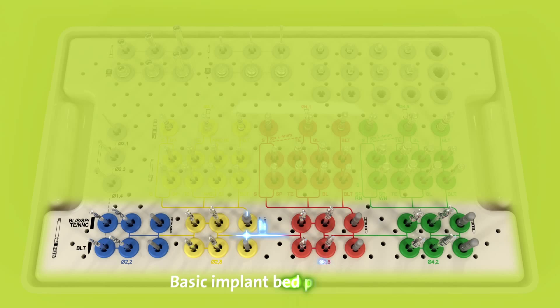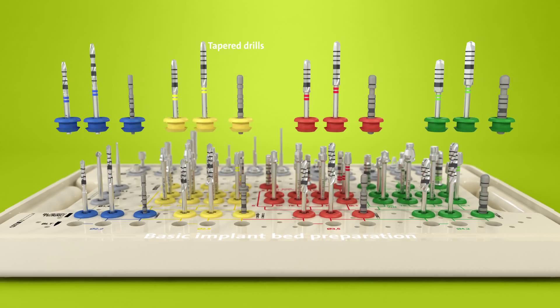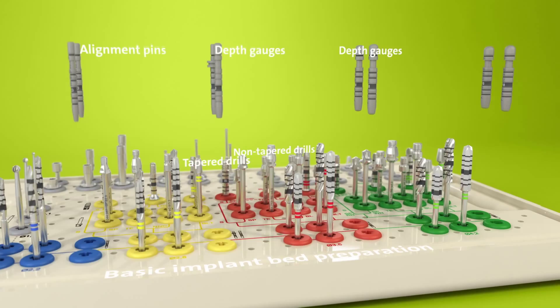The lower area contains all the instruments needed for the basic implant bed preparation. Here there are two lines of drills located one above the other: a line of tapered drills used for the bone-level tapered implants, and a line of non-tapered drills used for all other Straumann implants. For ease of use, pictograms indicate the respective drill lines.